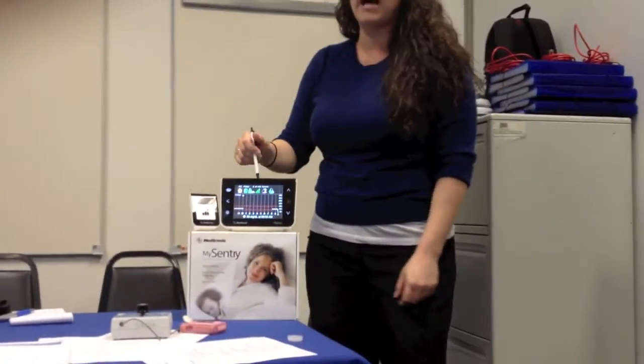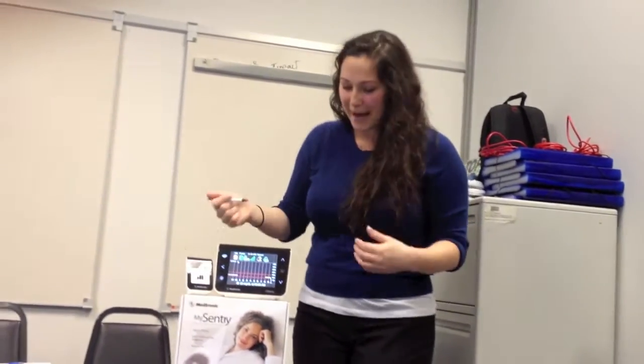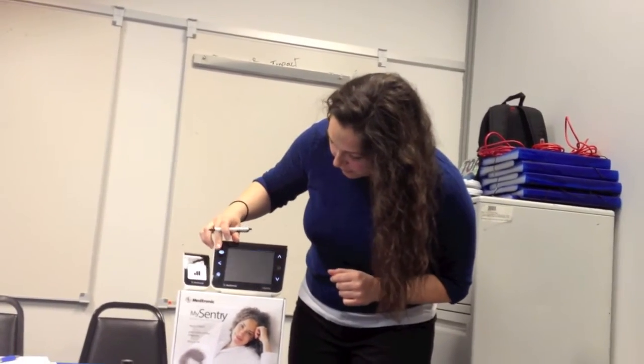Right here we have a stable line because this person, pretty much all night, I had them at 100 on this sensor simulator, just to make sure we weren't alarming in the middle of the night. This will also show your thresholds. The thresholds you've set on the pump, it'll actually show that. So whenever you go outside of those thresholds, you will have a better understanding of what's going on with me, and I can see it in real time. Okay? Next you go through, and this is called a privacy screen.